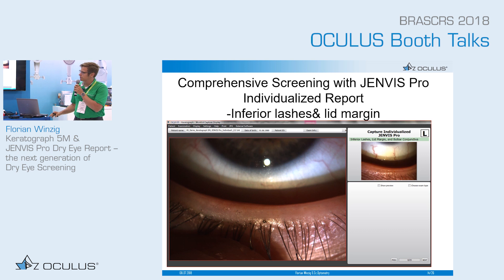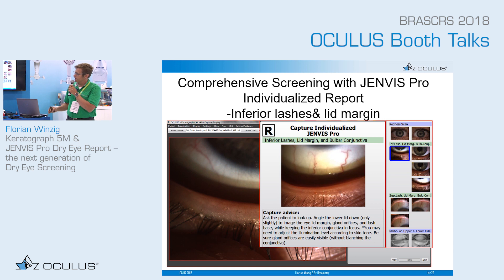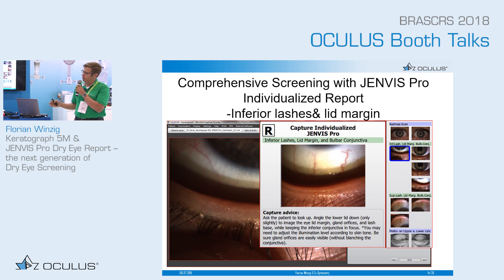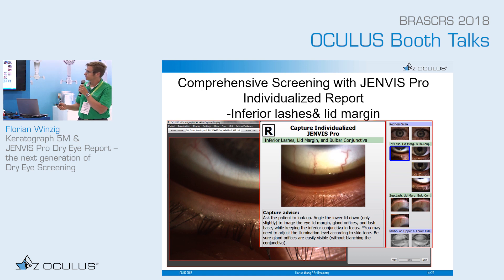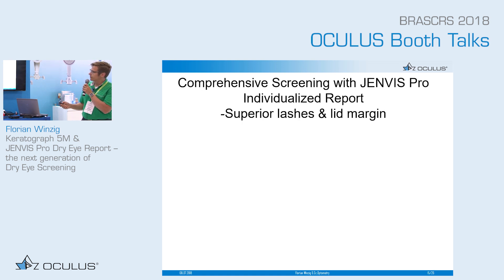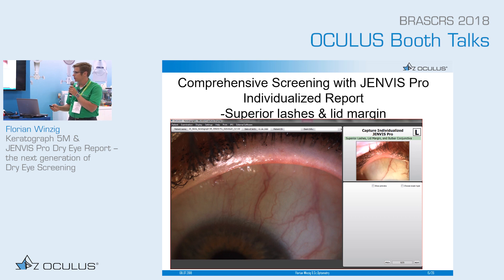Next we look at the lid margin and lashes. The aim is to identify any scalloping or notching at the lid margin, saponification, redness, or blepharitis. You can also examine the superior lashes and lid margins and incorporate those findings into your diagnosis and assessment.